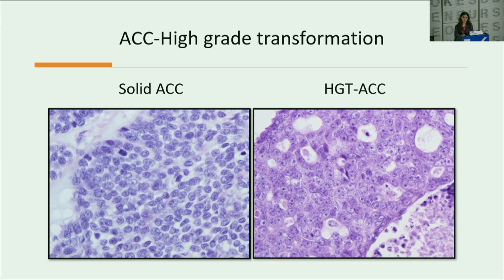Also notice that this case has a cribriform pattern and not solid. So like adenoid cystic carcinoma, high-grade transformation is not always solid and can have a cribriform pattern. This is important because I've seen this called salivary duct carcinoma before. The basaloid morphology, the absence of AR positivity, and the myoepithelial differentiation can help differentiate adenoid cystic carcinoma with high-grade transformation from salivary duct carcinoma in these cases.